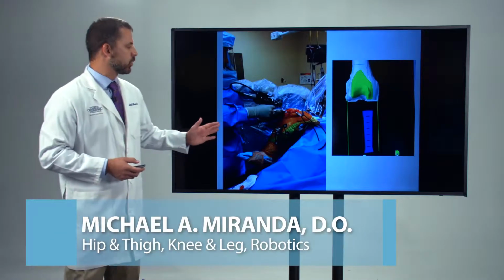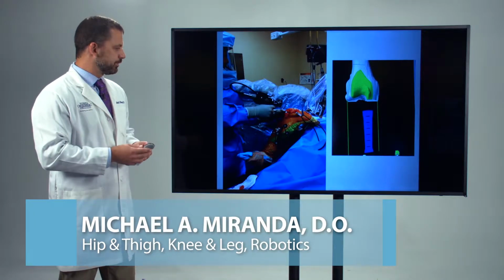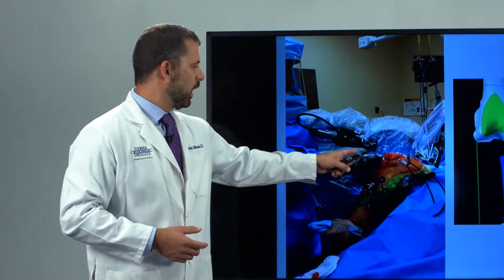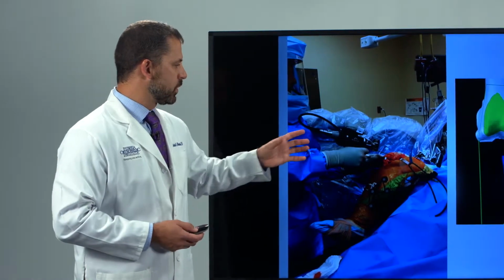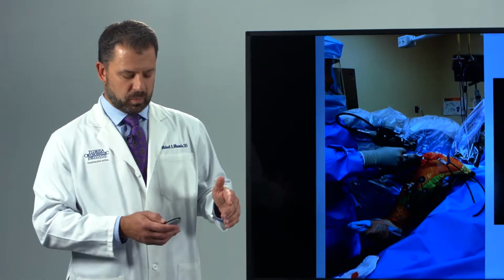Okay, so this is an actual picture of the live surgery. I physically run the robot in a sense that this is like a trigger for a bone saw, and my index finger here is on the trigger. You hit the button and the saw then comes into the plane that it's going to cut. Then you hit the button a second time and the saw blade will actually move.